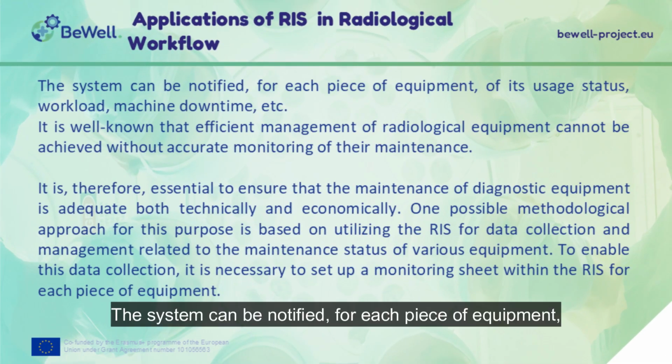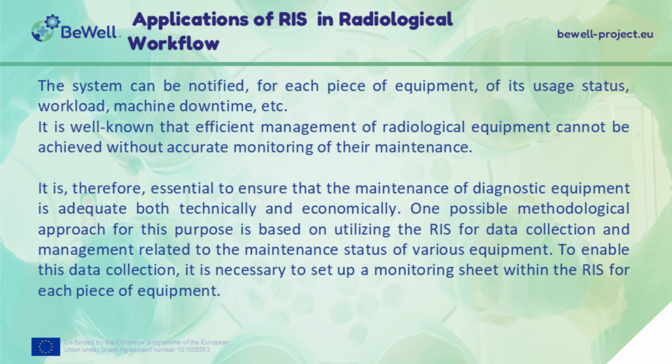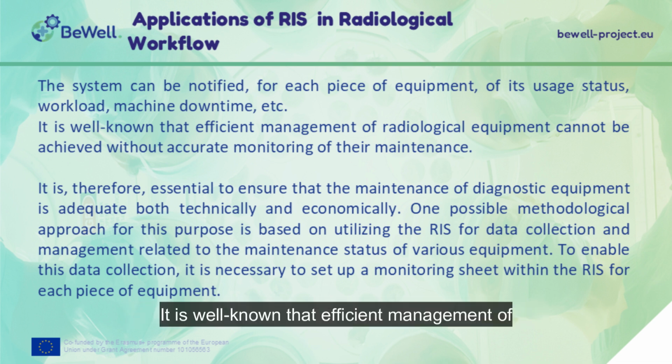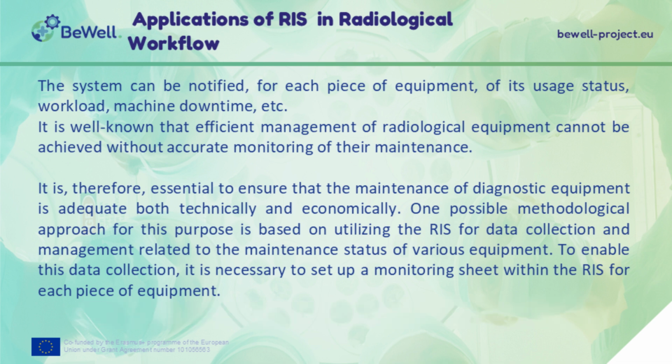The system can be notified, for each piece of equipment, of its usage status, workload, machine downtime, etc. It is well known that efficient management of radiological equipment cannot be achieved without accurate monitoring of their maintenance. It is, therefore, essential to ensure that the maintenance of diagnostic equipment is adequate both technically and economically.